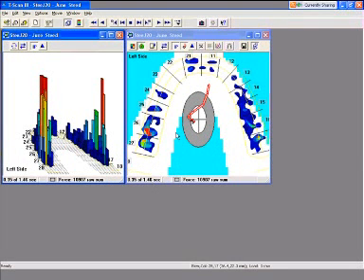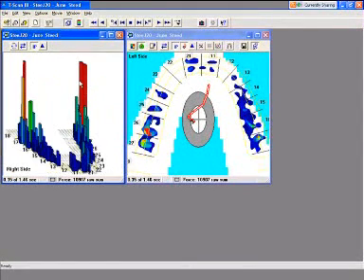You really use the information. I closed the graphs and I simplified it by shutting off all of the individual tubes because I really want the patients to see just a few things. I don't want them to see everything. And sometimes too much information is overwhelming, but this is really straightforward. This doesn't take an engineer to realize that if all of the forces are here in this area, long term it's not good. And you can use an analogy.